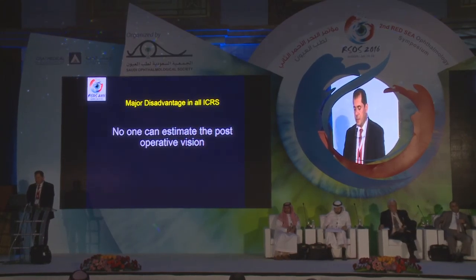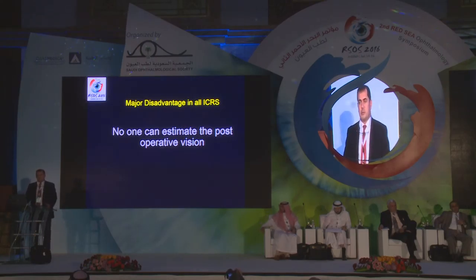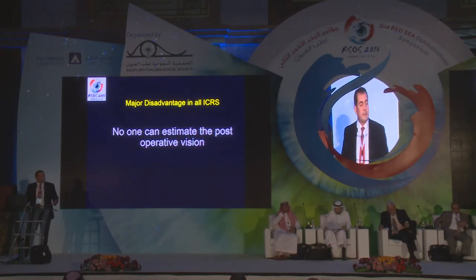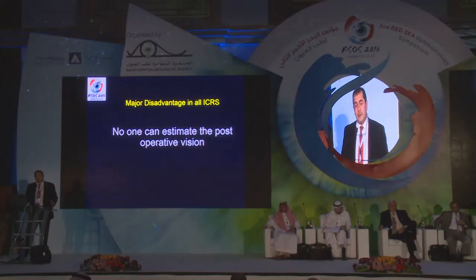Major disadvantage: no one can estimate the post-operative vision. And always the patient is asking, can you tell me how my vision will be after the surgery? That's the main problem with the patient, that you just tell him, I can't. Most probably you will improve. Maybe your uncorrected visual acuity will not improve, but the best corrected will improve. That's usually the problem with the patient.